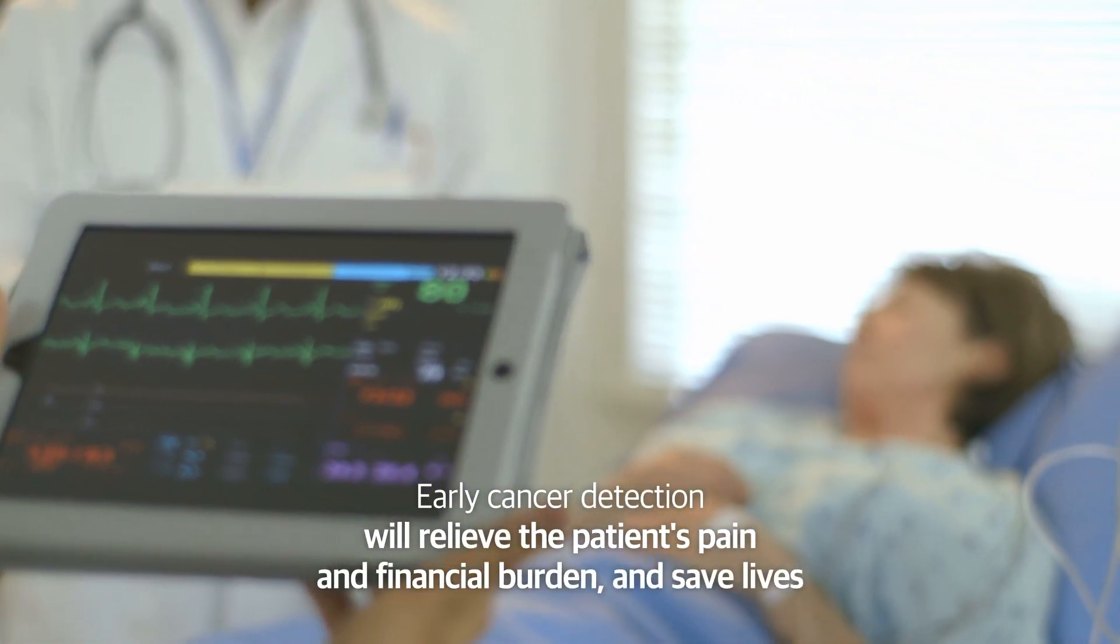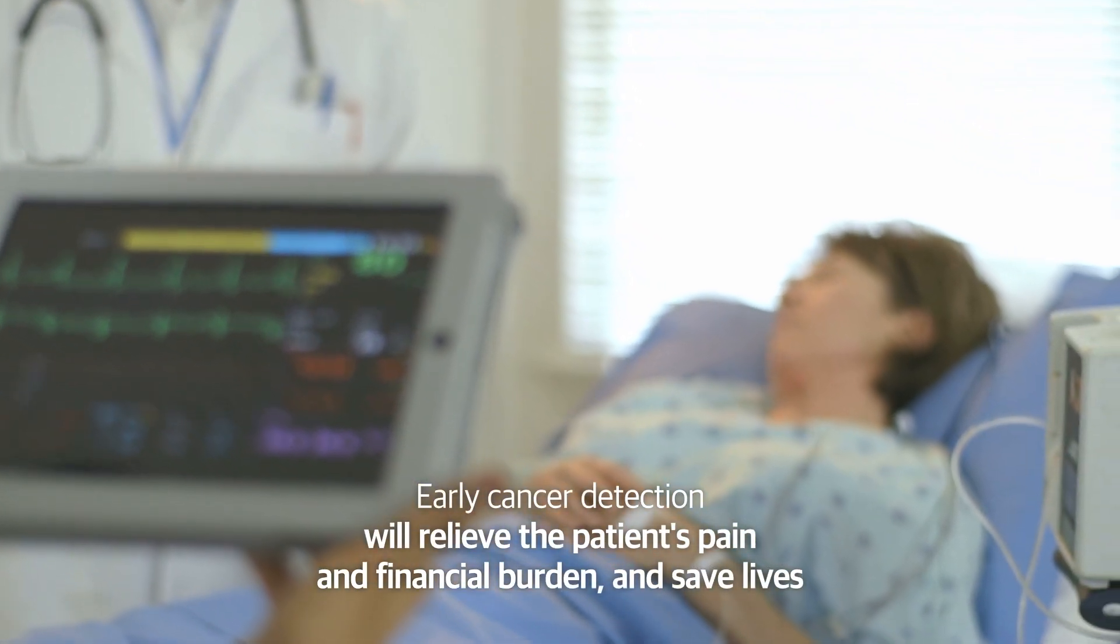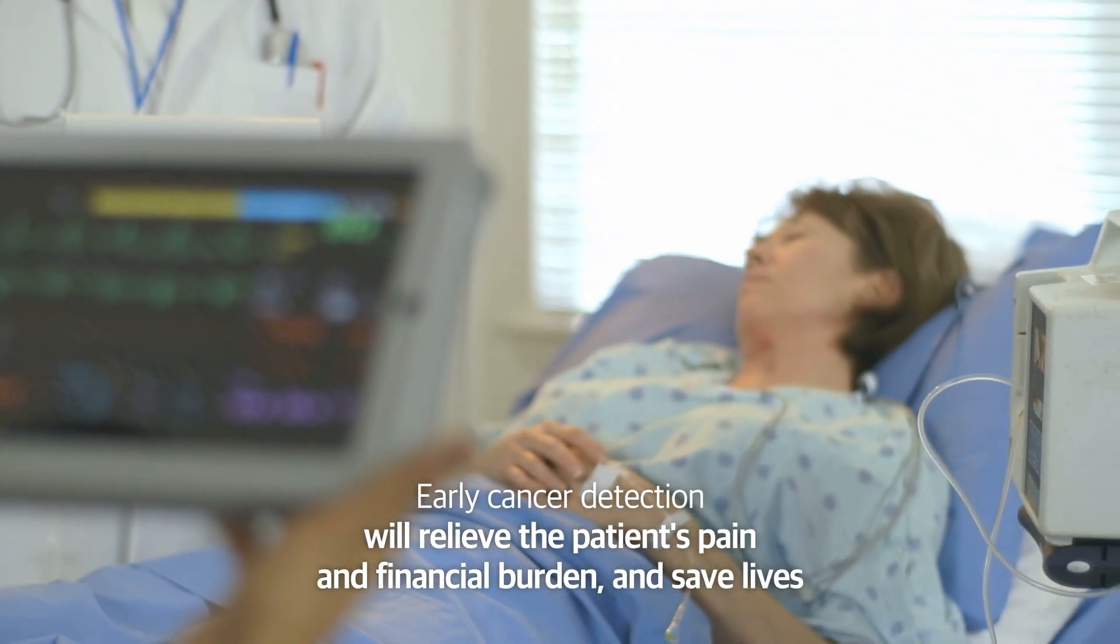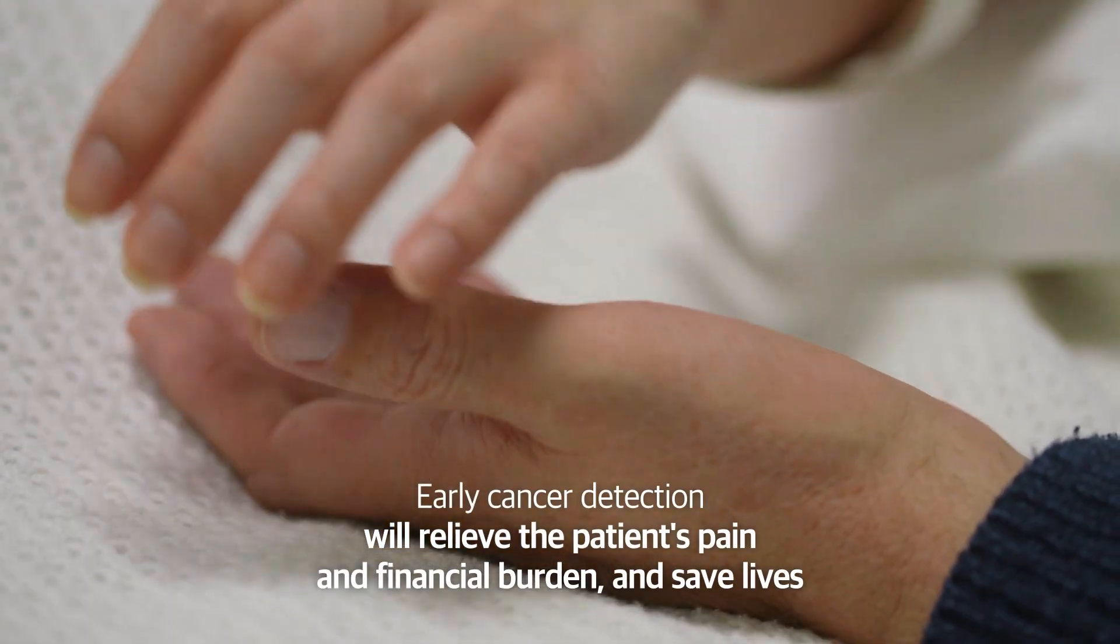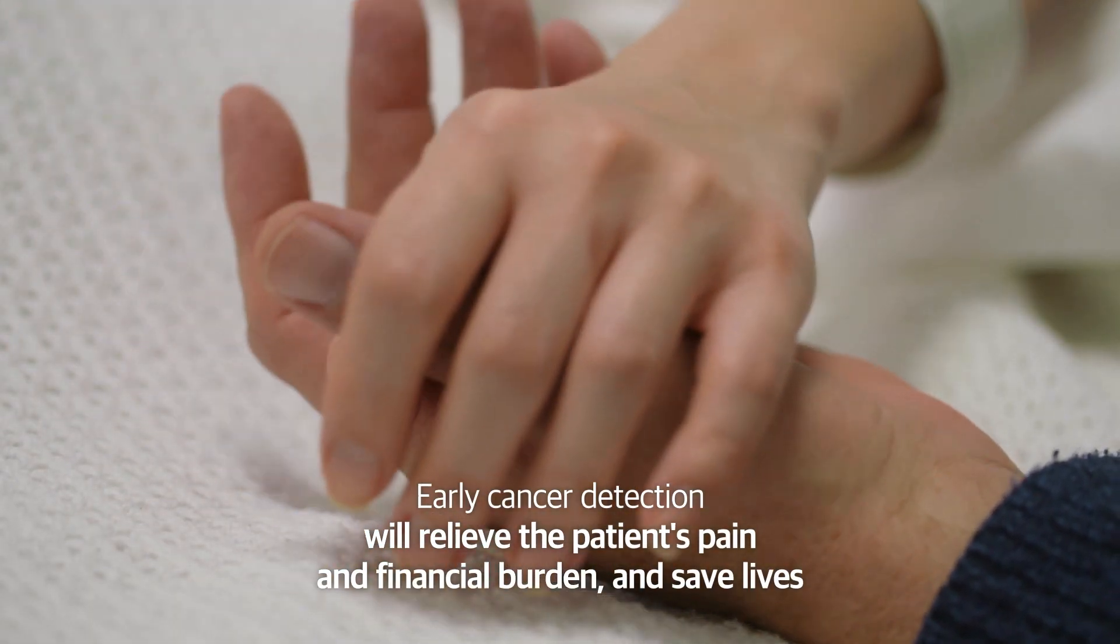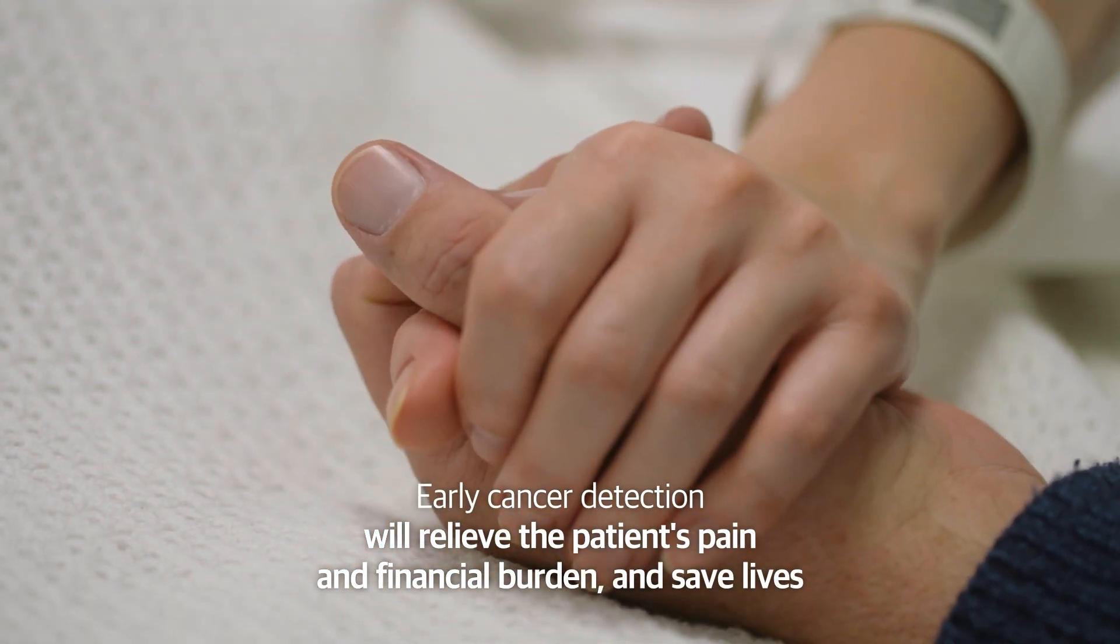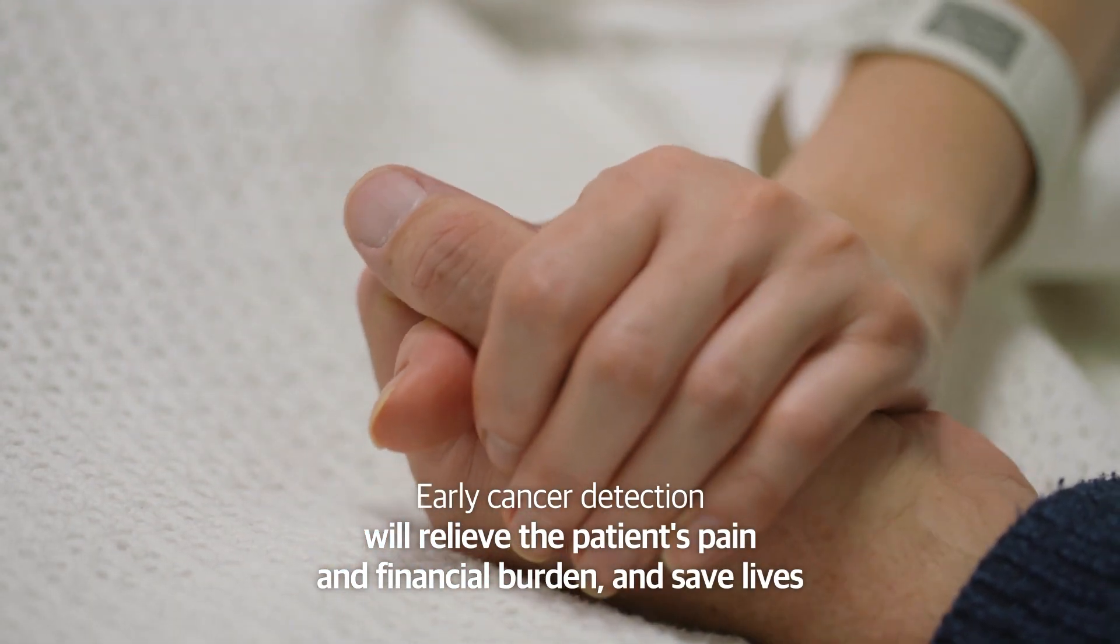In particular, early cancer detection will relieve the pain and financial burden and save the lives of those who suffer from late detection.